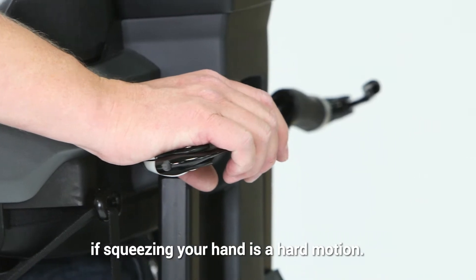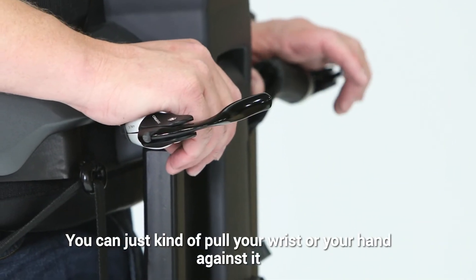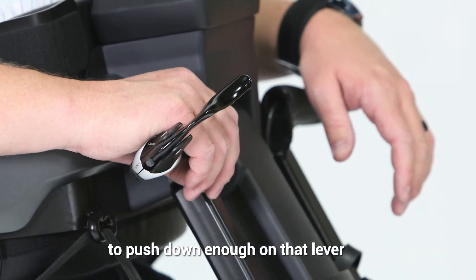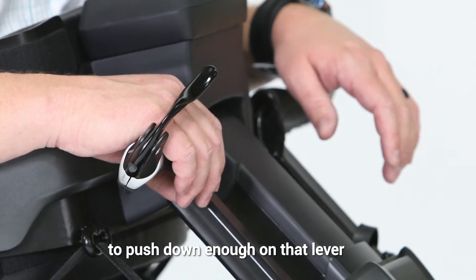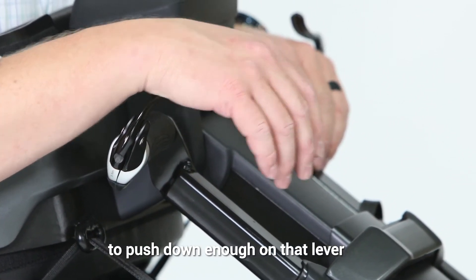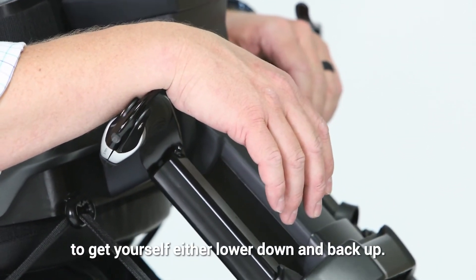If squeezing your hand is a hard motion, you can just pull your wrist or your hand against it to push down enough on that lever to get yourself either lowered down or stood back up.